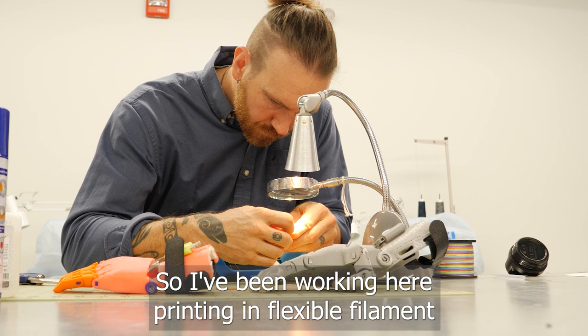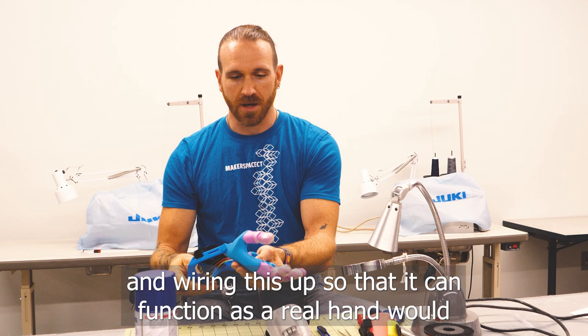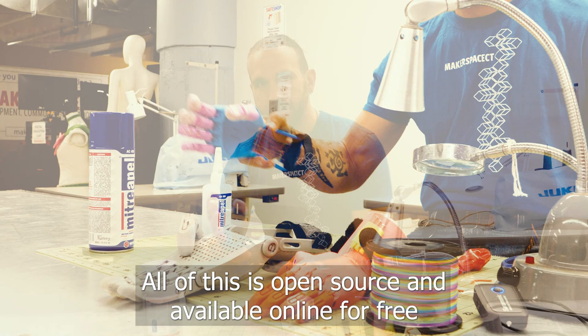I've been working here printing in flexible filament and wiring this up so that it can function as a real hand would. All of this is open source and available online for free, and these will be donated to people who have requested them online.